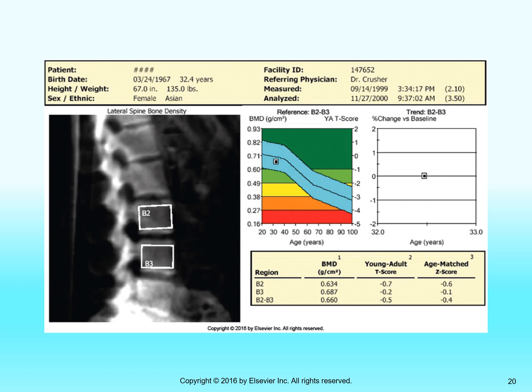And then you can see the color codes. Those are your fracture risks. So the green zone, that's considered healthy bone strength. And then in the yellow zone, that's considered at risk. And then high, moderate, and extreme risk are the orange and the red zones on that chart. So pretty easy to understand.